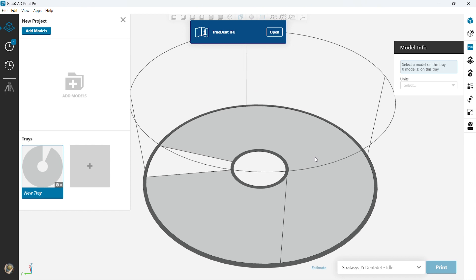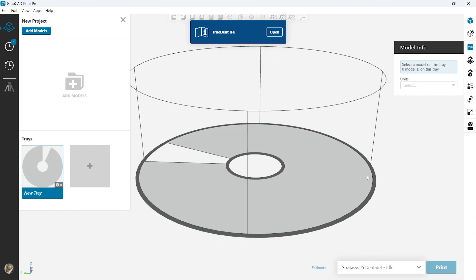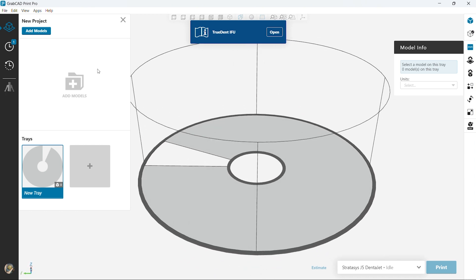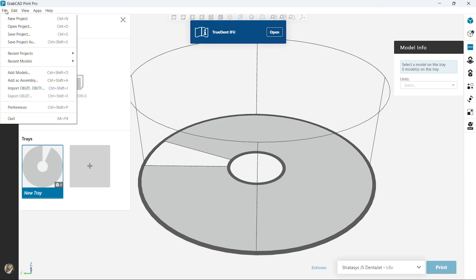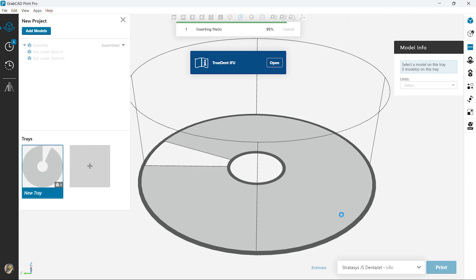Stratasys and the GrabCAD software gives us a great opportunity to add color in different libraries. So right here what we're going to do is add in a teeth and gum assembly of a lower denture, so import it there.